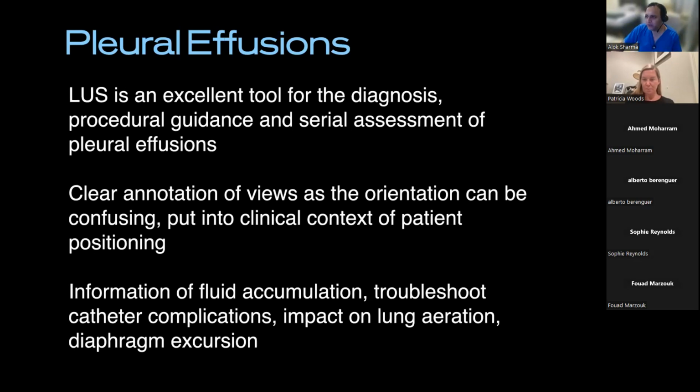Alberto, are you able to unmute yourself? Yes, I am. Thank you for it. Thank you, Dr. Patricia, for a wonderful talk. I would like to know, because in the adult world, the measurement of the fluid, the position of the patient has an impact on the estimation of the volume. Is it the same in the newborn, or is it different? How can we estimate the volume?